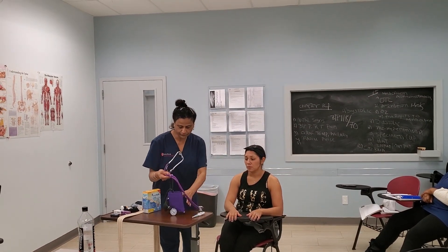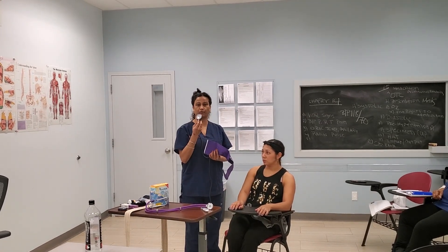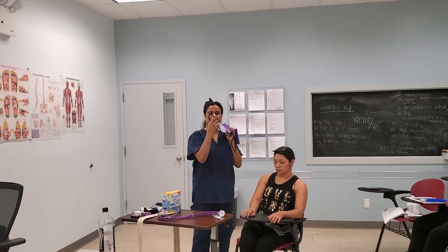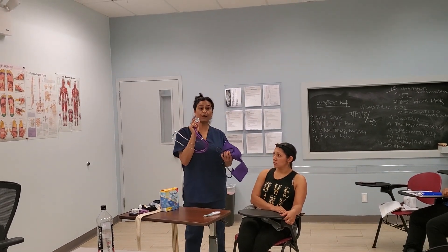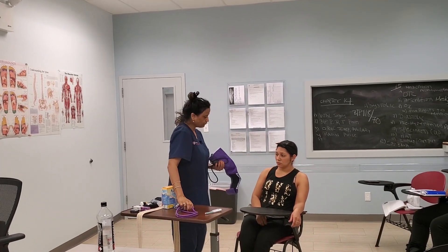My equipment: I have a blood pressure cuff, this is called a sphygmomanometer. It goes from 0 to 300 millimeters of mercury. I have my releasing valve. I have my stethoscope — this is the part that goes into your ears, this is the diaphragm, and this is the bell. The diaphragm's main purpose is to pick up high-pitch sound; the bell is to pick up low-pitch sound.